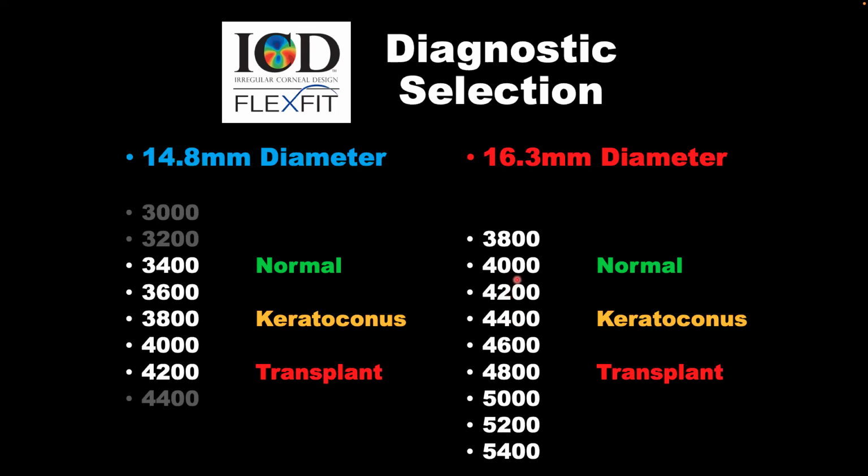So as well, if you need to decrease more than 200, just go back to the 4000 microns lens. I mean, what's the most time that you will take just by changing the lens? Maybe a minute. Even if you go slow, you can do it in less than a minute.